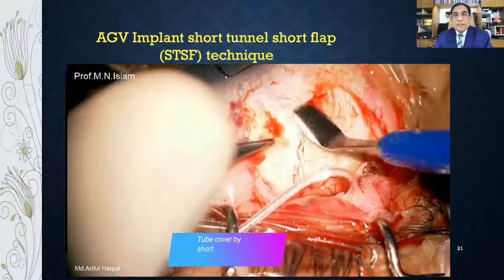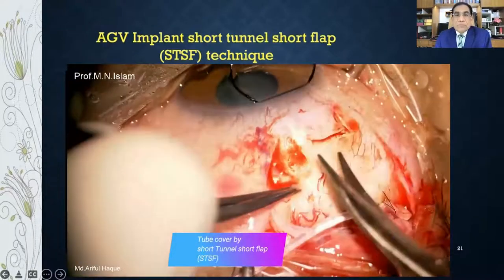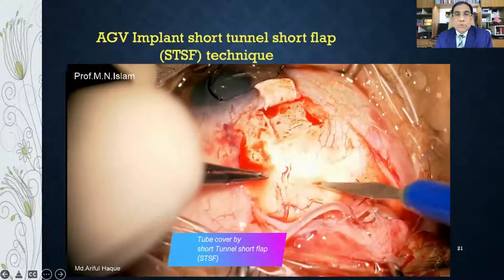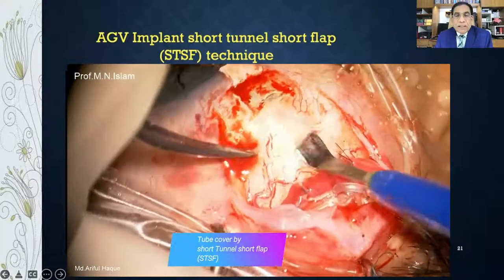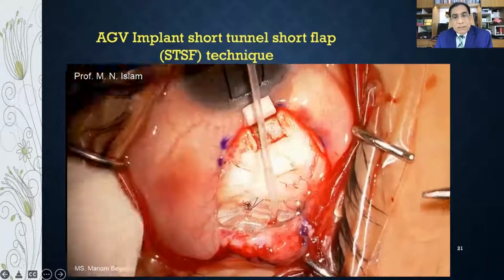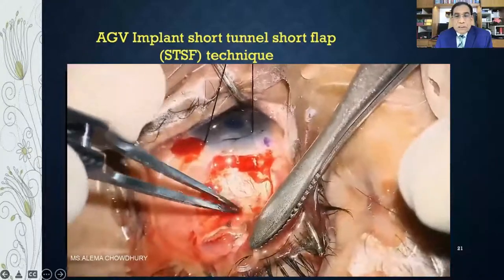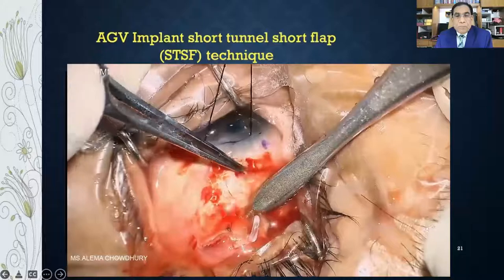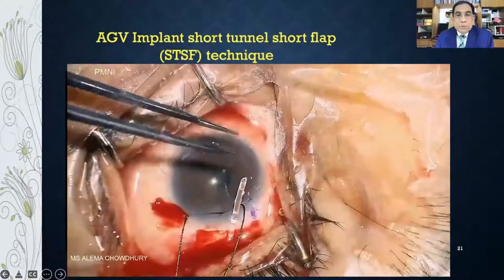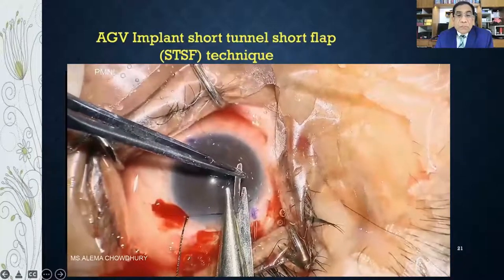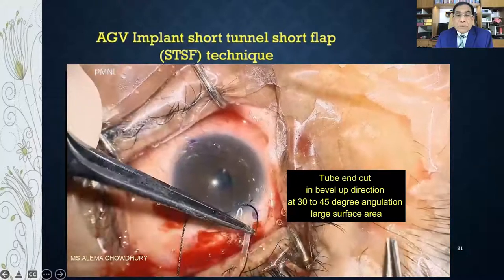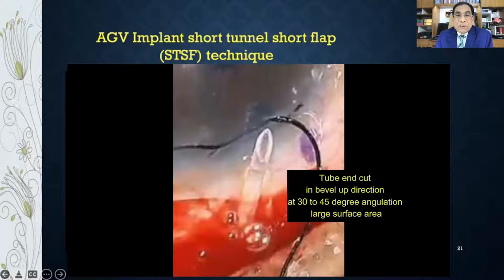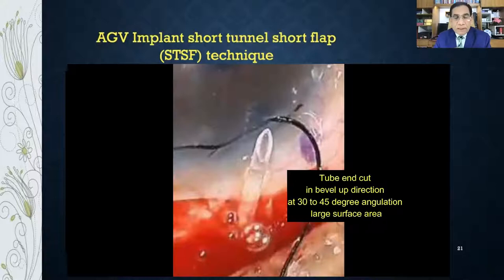Now doing the STSF technique: making a short scleral flap of about 4 mm — just like trabeculectomy — and a short tunnel. The tube is passed through the tunnel and placed under the flap into the anterior chamber. Very important: cut the tube end in a bevel-up direction at 30–40 degrees angulation. This gives more surface area for better aqueous outflow.